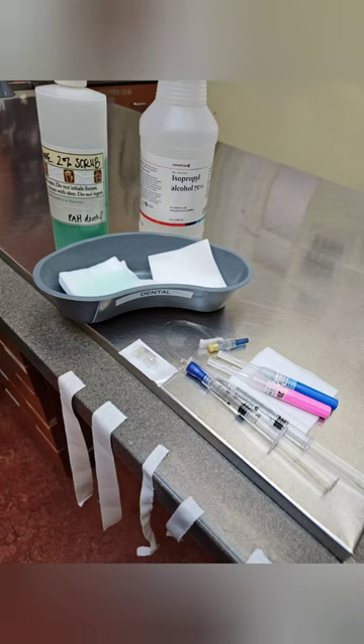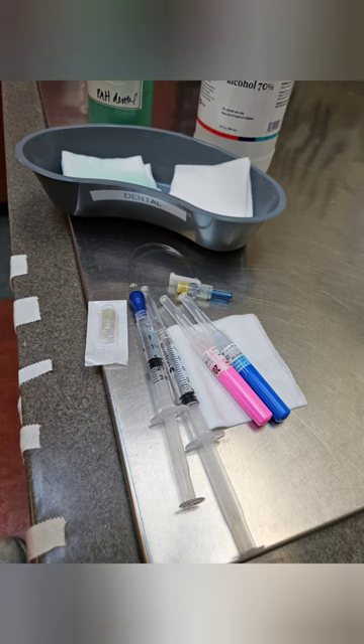Hello, here we are going to be placing an IV catheter in a dog, and here is a picture of the supplies we need for setup. To clean the area we need alcohol and chlorhexidine scrub that we have in a bowl. We have tape lined up, two sizes of catheter, some gauze, an injection cap and a t-set, and that will vary what we would like to use based on the procedure.